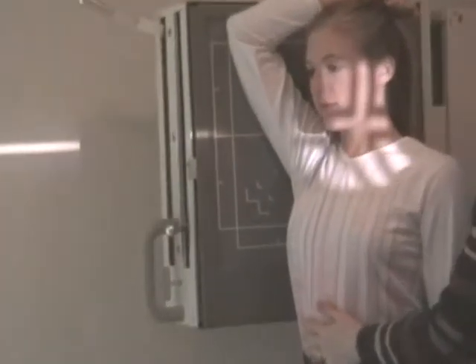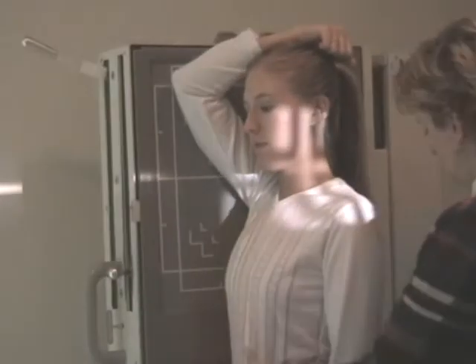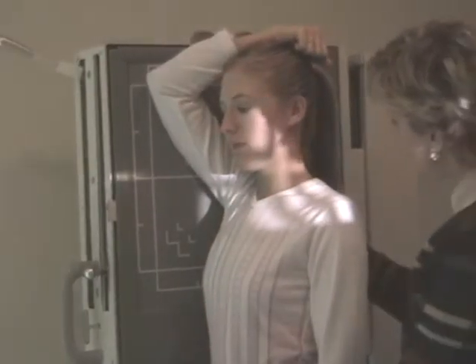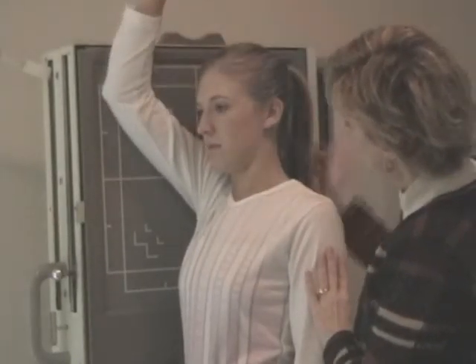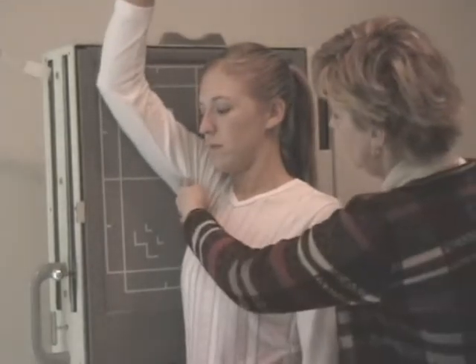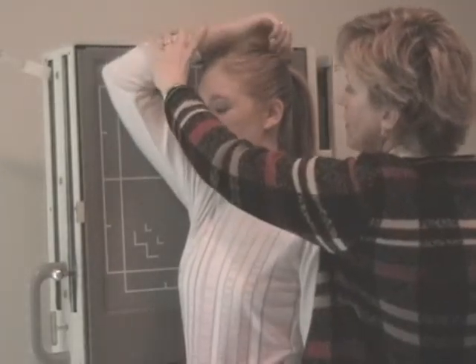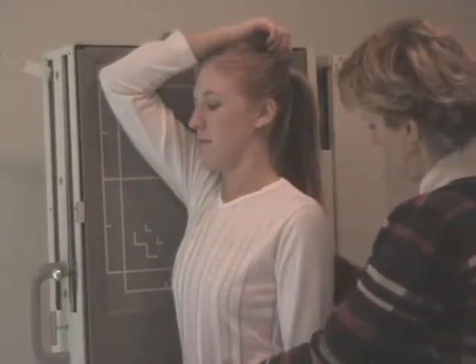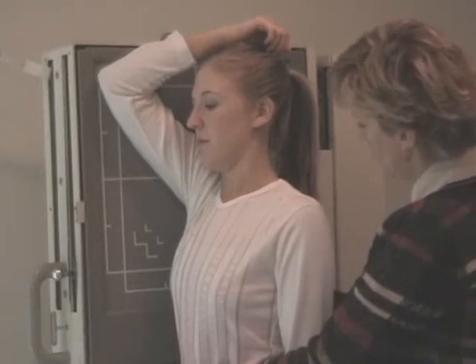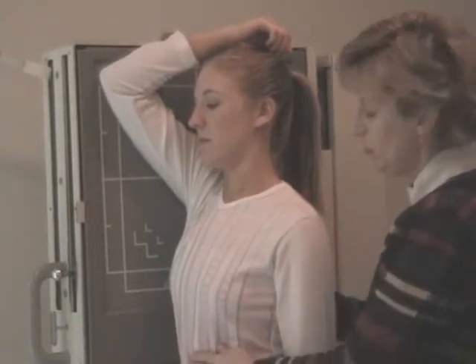Okay? Now you want to keep her into a lateral position. So I want her thorax in a lateral position, checking her hips and her shoulders. And then this arm closest to the board comes up, raises this humeral head, but notice how it's going to be underneath the cervical spine too. So that's why this is not a primary one. This is a backup one just to get C7. Make sure there's no problems with C7. And then this arm is relaxed and down. Okay, that's the position of the patient.